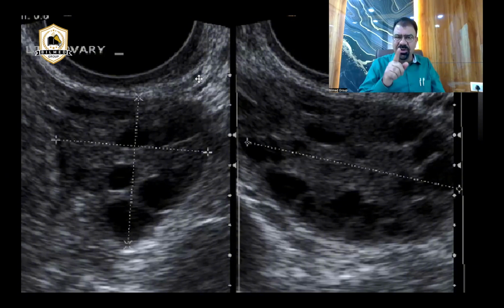There is a knob in your machine for pulse repetitive frequency. Now you will go into your machine, put your physics to use, and see what happens if I am increasing or decreasing the pulse repetitive frequency. The basic question is what I have to do with the PRF if I am dealing with an RPOC and have to see slow flow. I'm giving you the clue: for slow flow, whether I have to increase the PRF or decrease the PRF.